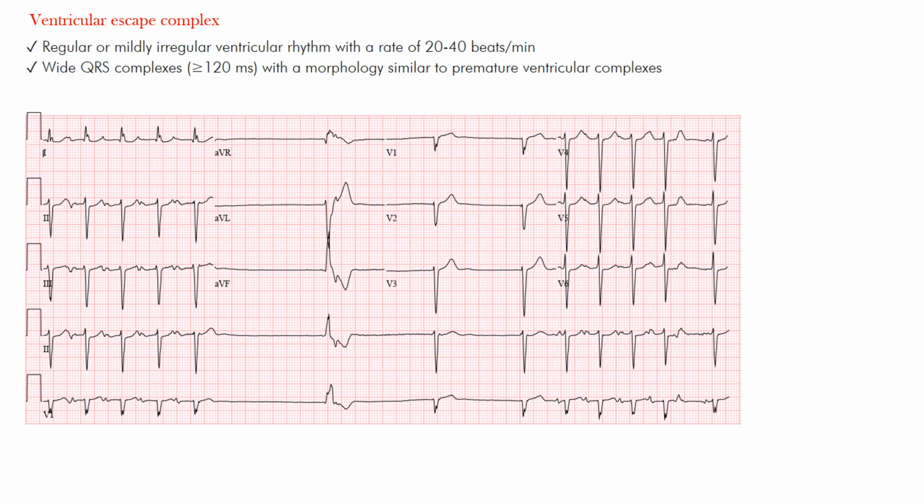So ventricular escape complex, or escape beat. You may hear them either way. What is going on here? Well, similar to a junctional escape beat, we have these safety nets in our heart, okay, in the conduction system, just like elsewhere in the body. And what happens is when an area above it doesn't function very well, there are areas that can take over pacemaking function. So that's the right atrium, the left atrium, right ventricle, and left ventricle, okay?